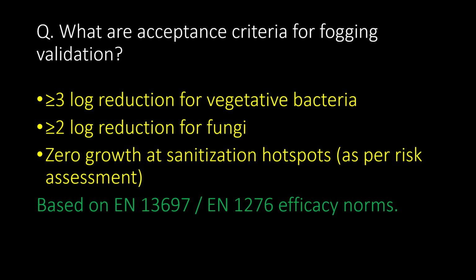What are the acceptance criteria for fogging validation? 3 or more than 3 log reduction for vegetative bacteria, 2 or more than 2 log reduction for fungi, 0 growth at sanitation hotspots as per risk assessment based on EN 13697 and EN 1276 efficacy norms.